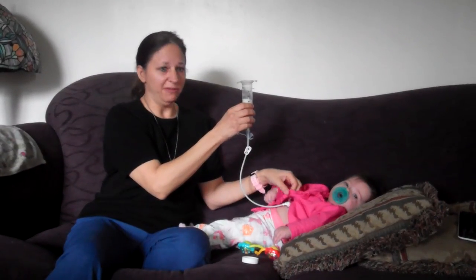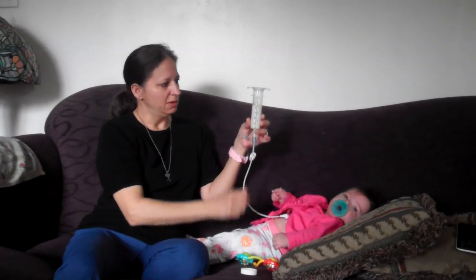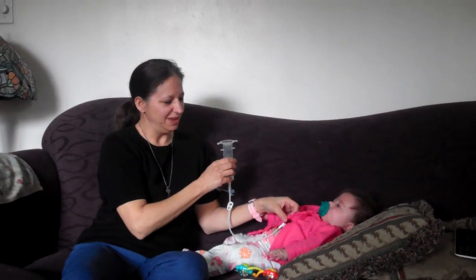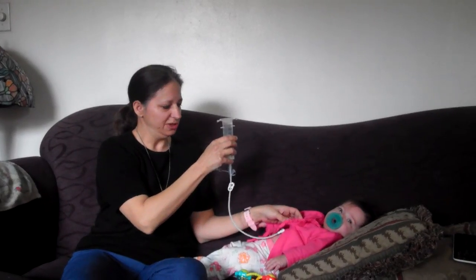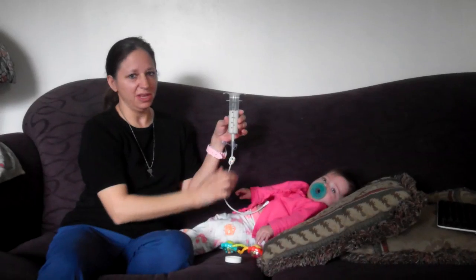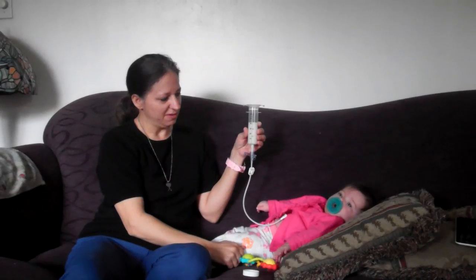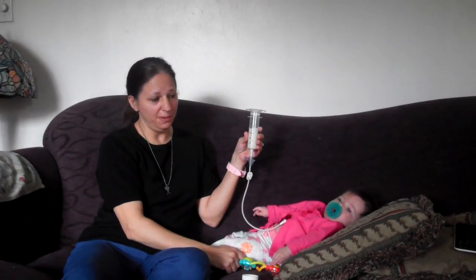So this is a gravity feeding, so the higher you hold it, the quicker it'll go. The lower you hold it, the slower it'll go. And you'll learn as you are feeding your baby and you're doing it more and more often, you'll kind of get a feel on when to lift it or when to lower it. Sometimes I'll even close the clamp if I think it's going too fast, because that might give her a belly ache if she gets it in her belly too fast. A feeding should probably take 20 to 30 minutes maybe.